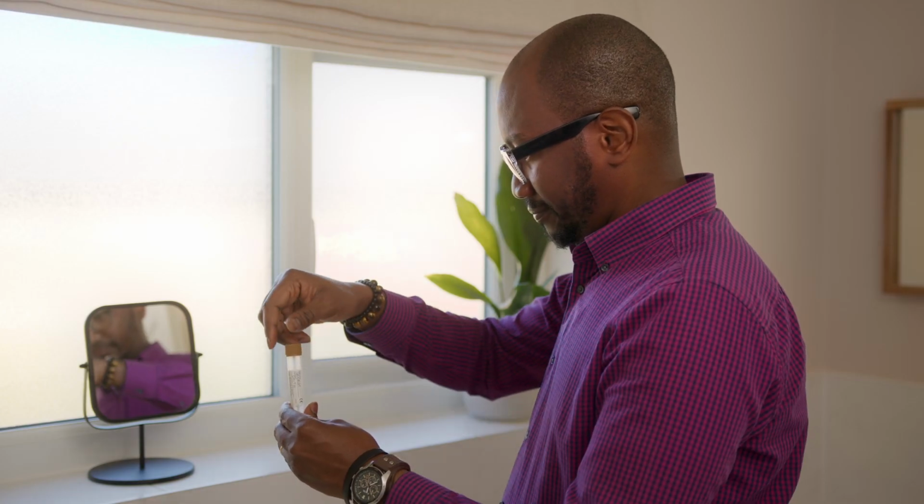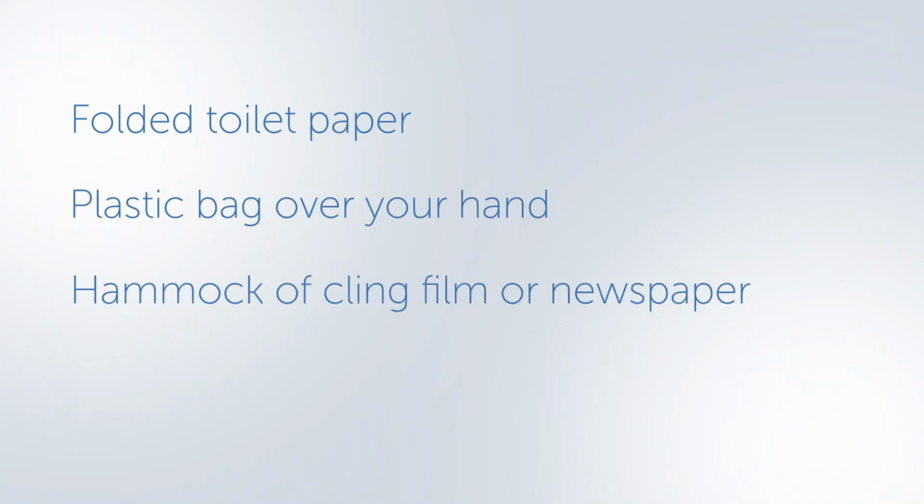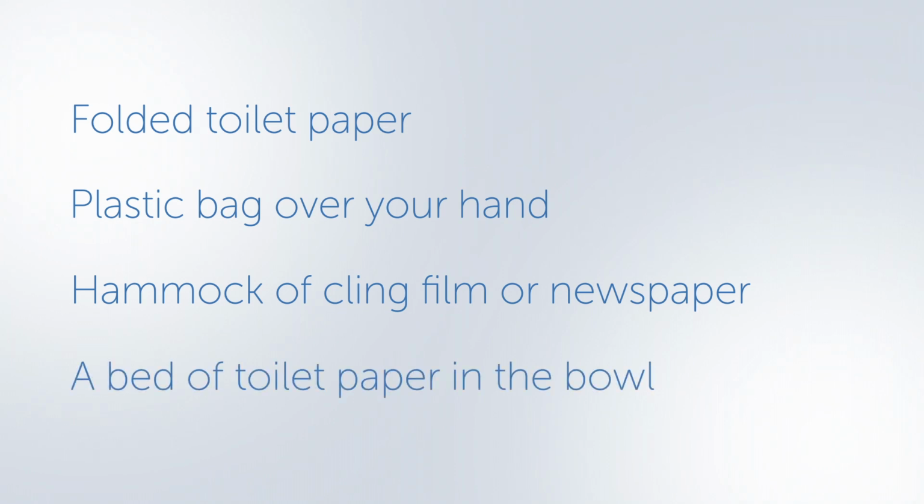Take your sample collection tubes with you into the bathroom. There are lots of different ways to catch your stool. You can use folded toilet paper or a plastic bag over your hand, a hammock of cling film or newspaper placed across the back of the loo seat, or a bed of toilet paper in the bowl. Two things to keep in mind. Firstly, we need to try and avoid the stool touching the toilet water. Secondly, we want to avoid getting urine in the sample, so try to pee before taking your sample.